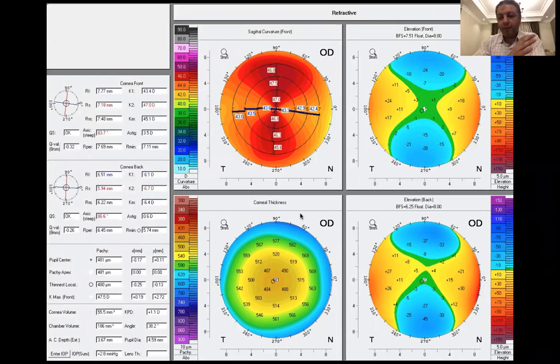Okay, but what about the epithelial thickness? 400 including the epithelium, right? Yes. Then we need to know the epithelial thickness, to measure it. Exactly. This is the importance of epithelial mapping nowadays. Okay, Dr. Yasser will tell us about it. What about the haze? Finally, this is the importance of Dr. Yasser Rifay nowadays.